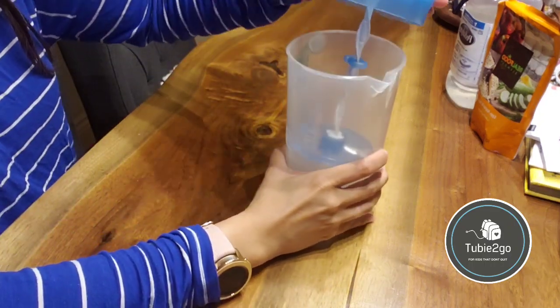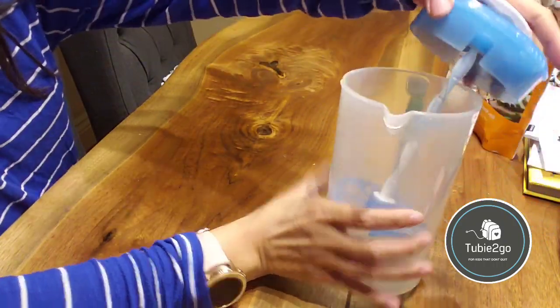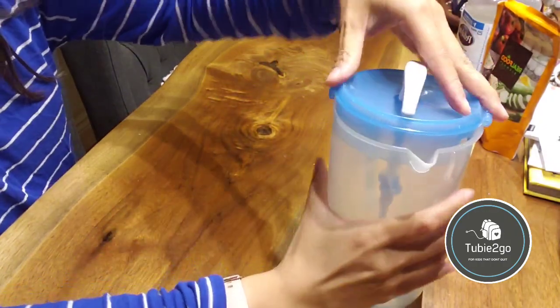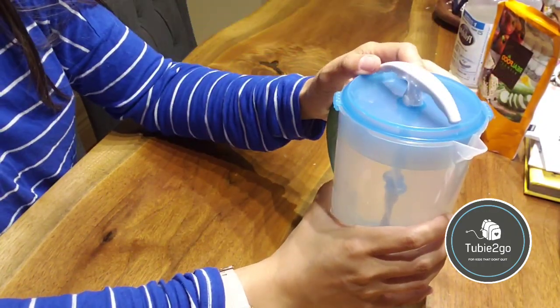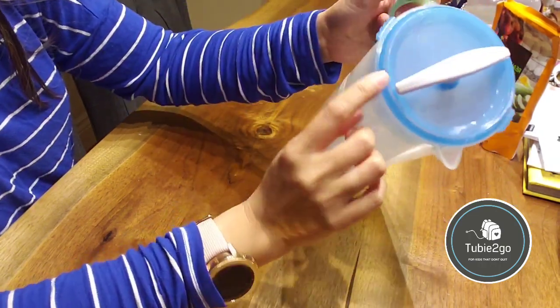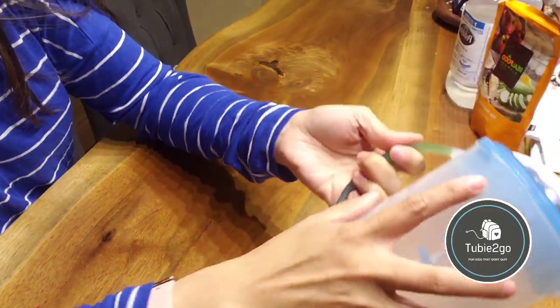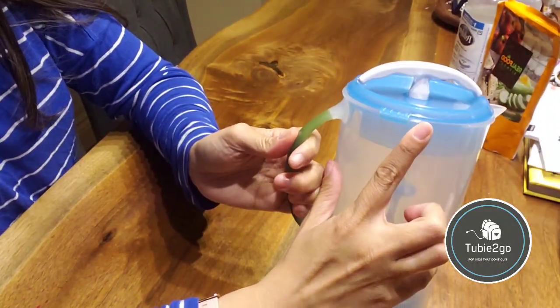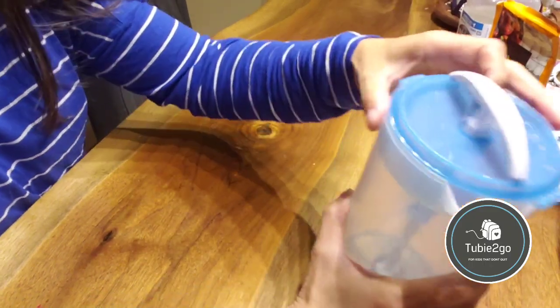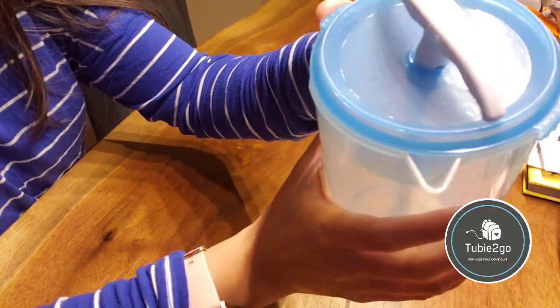Another feature on this pitcher is that there are little hinges on the cap, so that if you twist it in a certain rotation it is contained and it's not going to slide off — much like a medicine pill bottle.